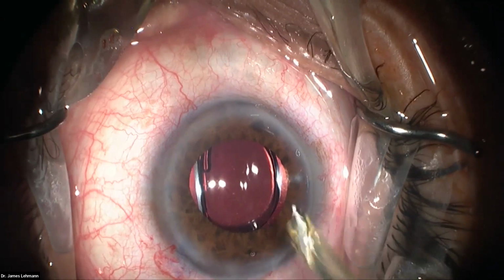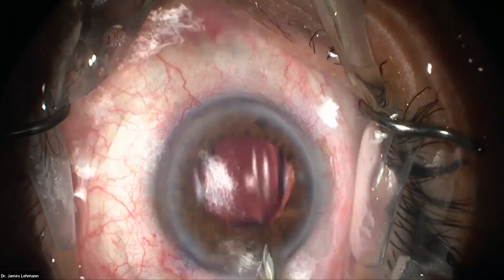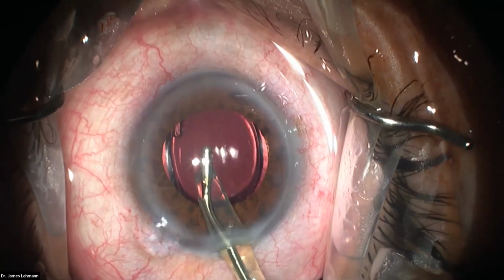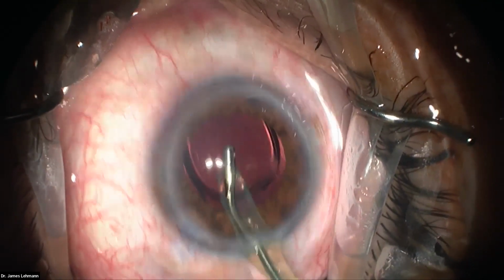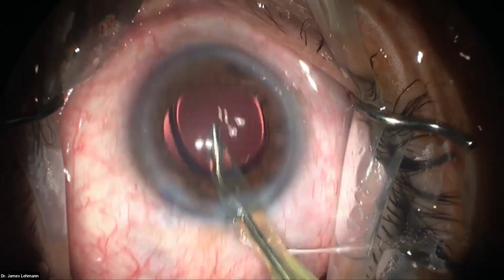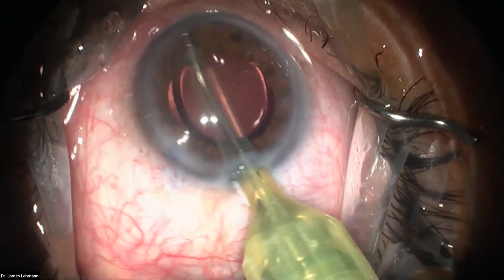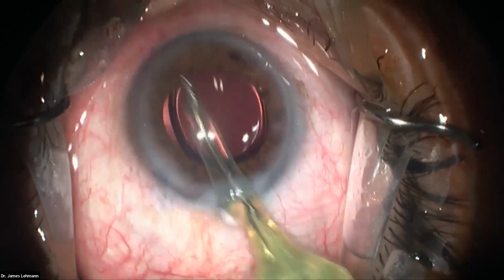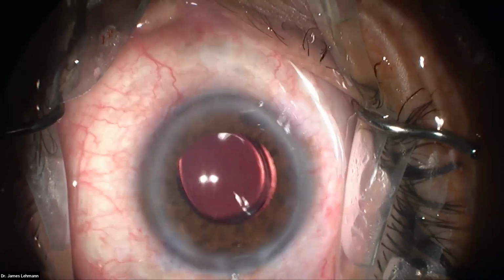Yeah, so now we're going to remove the viscoelastic. Our setting is just called visco. That just means it's going to have a high amount of vacuum. And look, I just kind of stay here in the middle of the eye. I don't need to go chasing stuff just quite yet. We kind of make sure all the viscoelastic is moved around the IOL, kind of push gently on it. Now I'm going again in this area near the angle to make sure there's no nuclear fragments. And it looks good. Nothing's coming. I'm getting constant flow there. So now we're done.